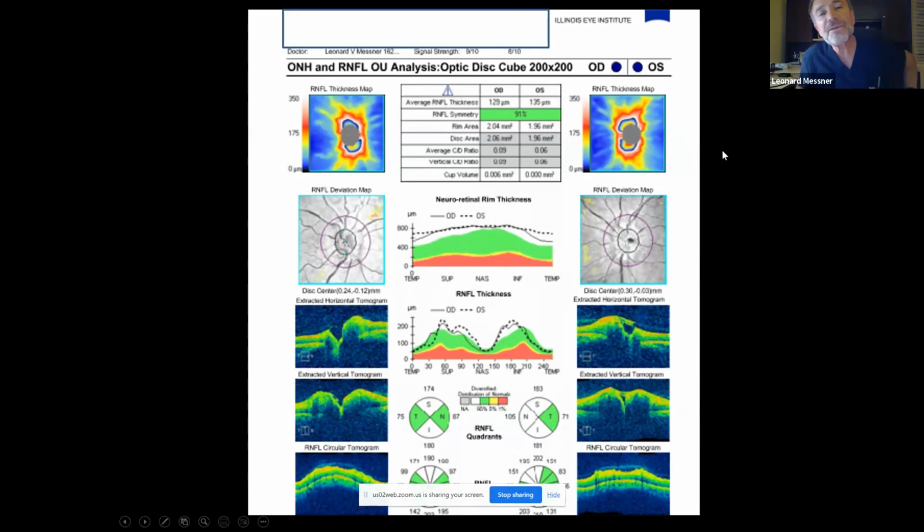But you've got to be careful with this, because with papilledema, if the nerve fiber layer is thinning down, that can be for one of two reasons. Either the patient is getting better or they're getting worse. As the nerve becomes atrophic, it will naturally flatten itself out. So you can't just look at the nerve fiber layer as determining whether or not the patient is responding to therapy or whether they're not.